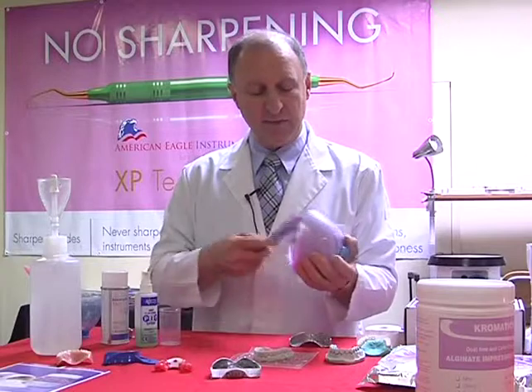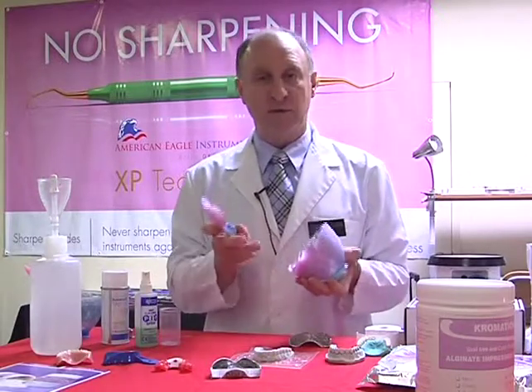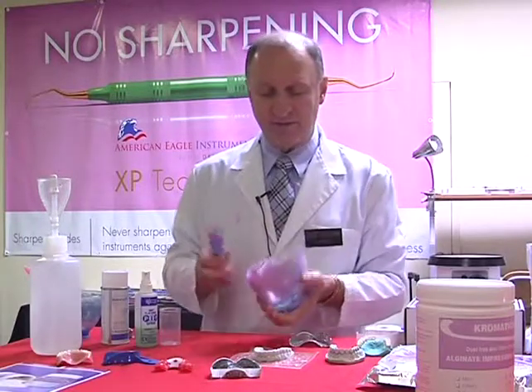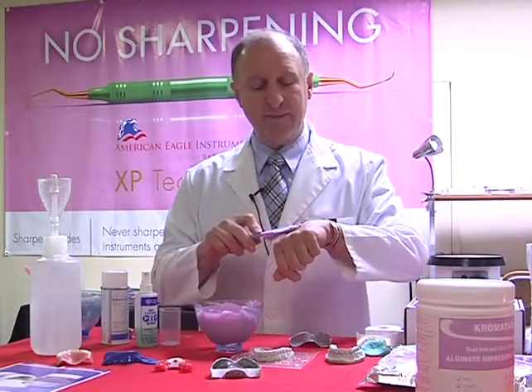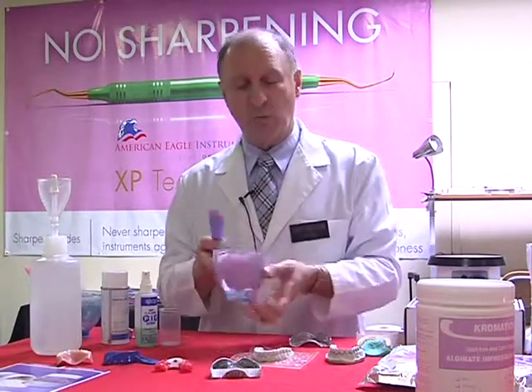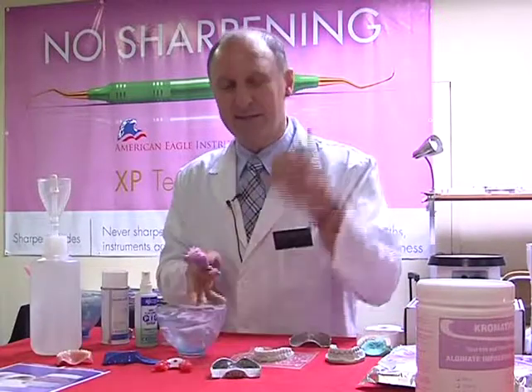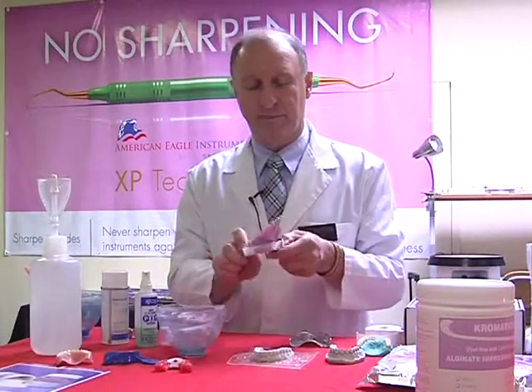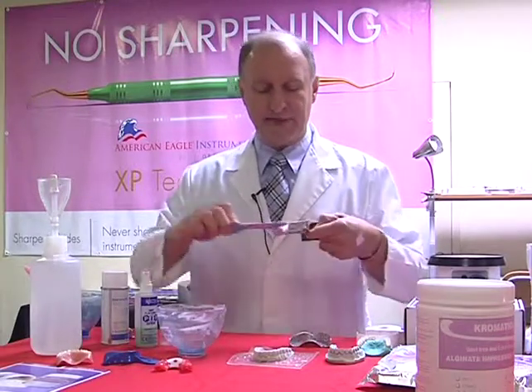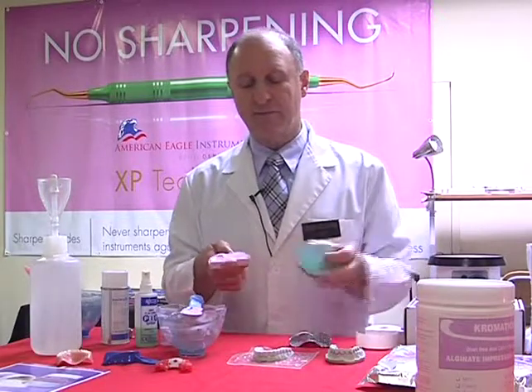Now, at this point, I've got our material that's mixed. I'm going to take a small amount of the material, and just to show you how we got a good mix of material, this is what we should be looking for. It's dense, it's thick, it stays on the spatula, it doesn't drip off. I normally take a small amount of the material on the back of the patient's hands and tell them to watch this whilst I'm going into the mouth to take the impression. So it's sort of, again, distracting them. So I'm packing my impression tray, and I'm now ready for our impression.